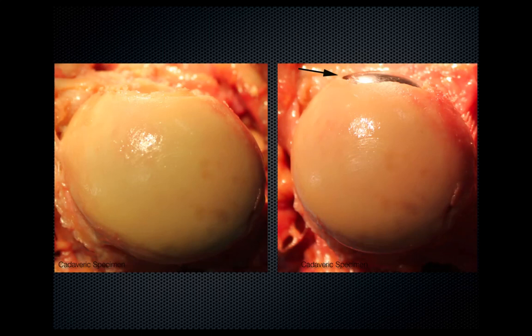One, however, can see if we view the HemiCAP at 90 degrees, we get a much better perspective on the depth of the implant. This is the advantage of the arthroscopic assisted technique, which we'll now describe.